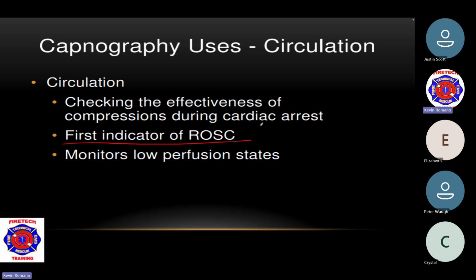Jackson First Alert, you guys have a Lucas device. That thing provides absolutely phenomenal compressions. It really does. I'm a big fan of the Lucas device. And with that, you're probably going to see higher end tidal readings. That thing does such a great job with piston compression that it might actually generate a blood pressure. So just keep that kind of stuff in mind. That's why it's so important to have mechanical CPR, because it doesn't stop until your battery dies, whereas we as human beings get tired, right? But that helps check our effectiveness to make sure we're actually perfusing the body appropriately by getting end tidal readings.